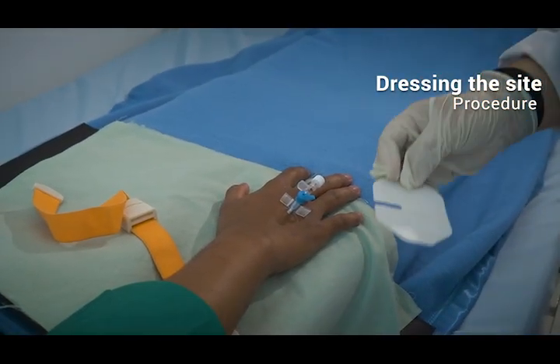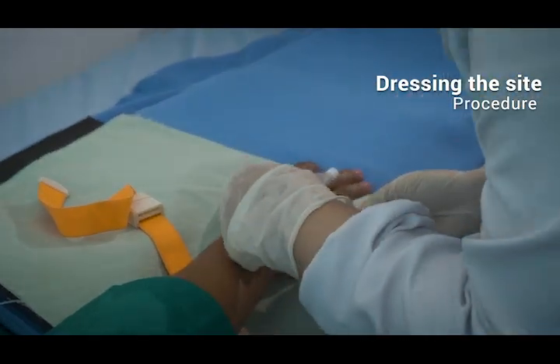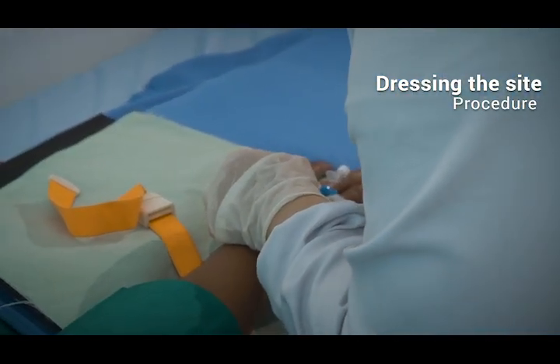Dressing the site. Apply a transparent semi-permeable dressing over the insertion site.